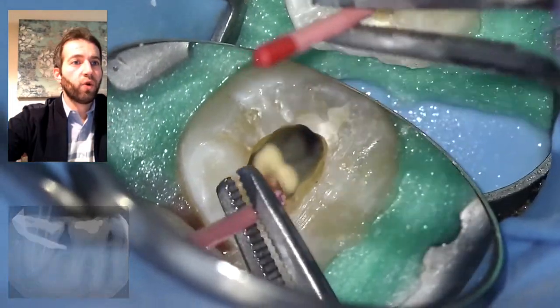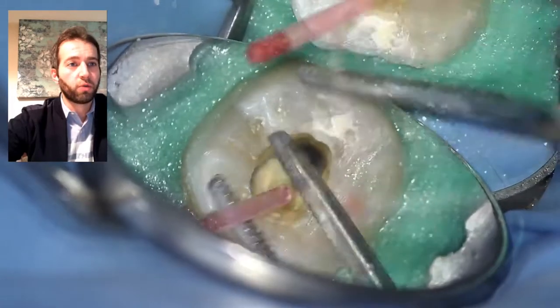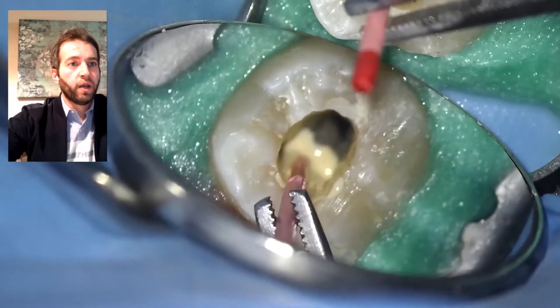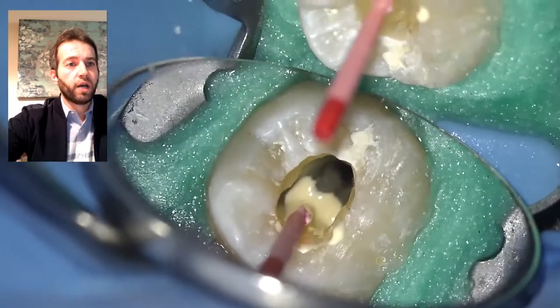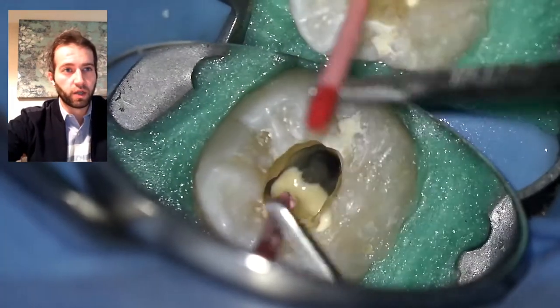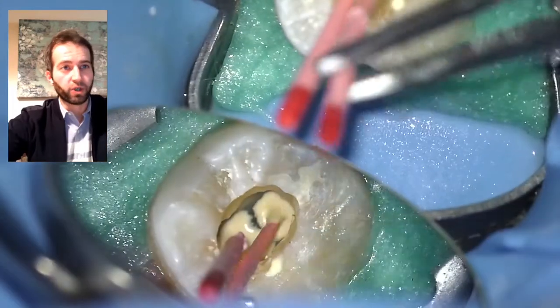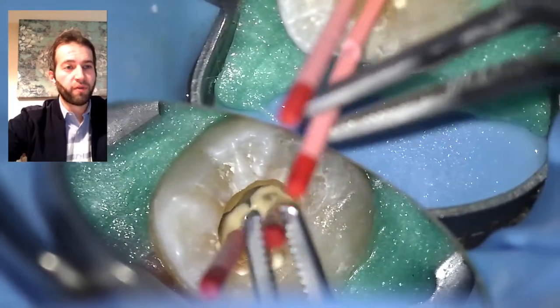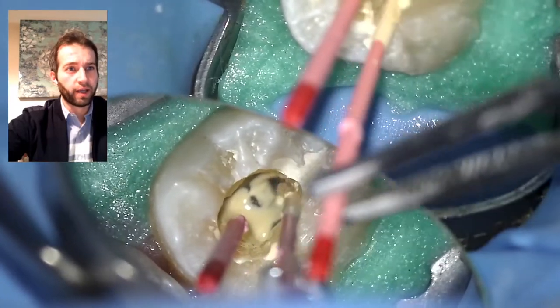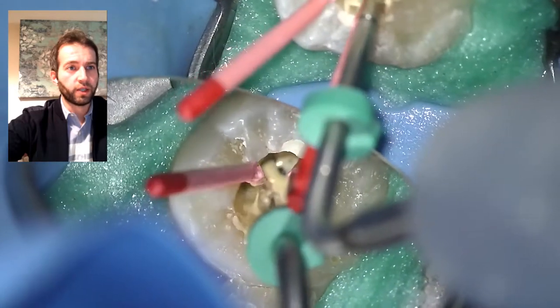Now I'm coating the four millimeters of sealer, going in a circular motion to make sure it's coating the entire canal. I add a little bit more sealer as needed, because sometimes when I take the cone out I see areas not covered. No pumping action at this point because you don't want excessive puff — a little is okay, but a lot I just don't like.